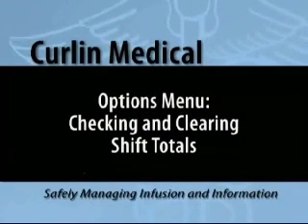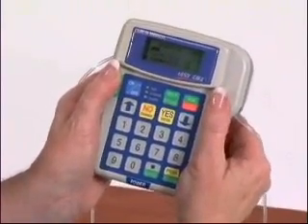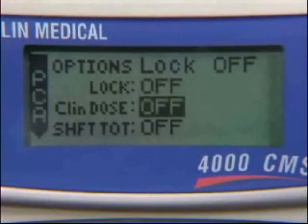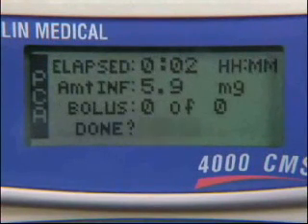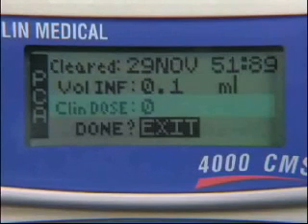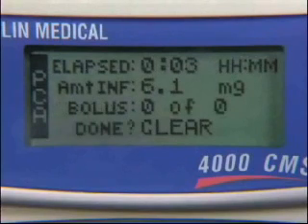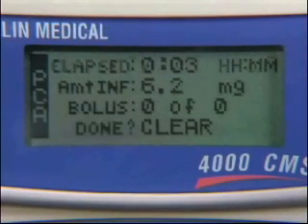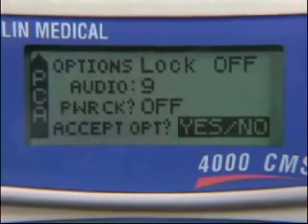To check and clear shift totals, record the remaining volume in milliliters from the main screen. Press the Help Options button to enter the Options menu. Use the down arrow button to highlight the shift total feature — the feature will read off. Press the No Change button to change off to on. Press the Yes Enter button to confirm on and enter the shift total feature. Review the information and record your data. The information on the screen will be volume infused, clinician dose amount infused, bolus given, and bolus attempted. To clear the information, press the No Change button to change Exit to Clear. The Done line will flash and indicate Clear next to Done. Press the Yes Enter button to clear the information — the screen will show the fields are now at zero. Press the Yes Enter button to exit the feature, then press Yes Enter again to accept options and return to the Run screen.